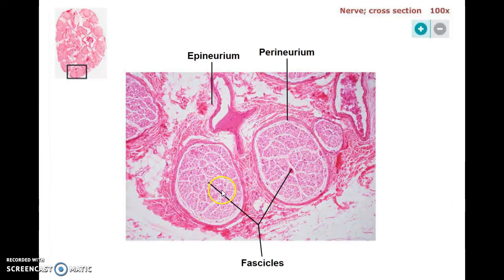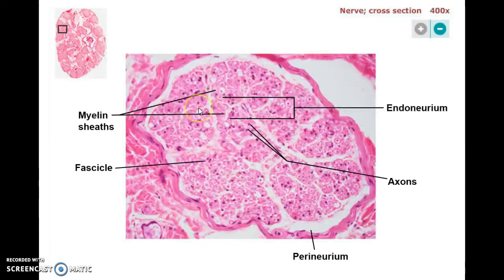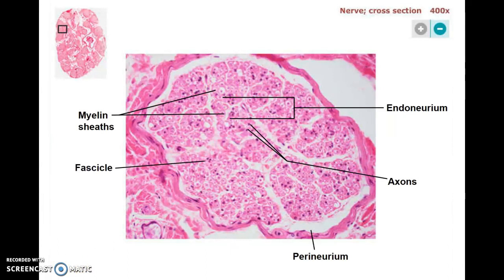This is now a nerve that's been cut in cross section. You can see the fascicles — the bundles of axons — with the perineurium around them, and the endoneurium, which is the connective tissue within. The axons themselves are so tiny that even under 400x they look like little dots when cut across. In some places you can see them surrounded by the whitish myelin material and the Schwann cells.